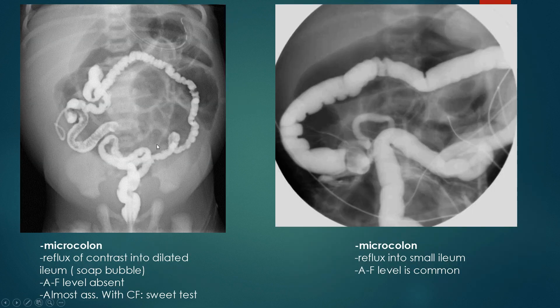In these two cases of micro-colon, we can see the colon diameter compared to the small bowel in the background. In the case of meconium ileus, the contrast will reflux into a dilated terminal ileum with multiple filling defects representing fecal matter, giving a soap bubble appearance.